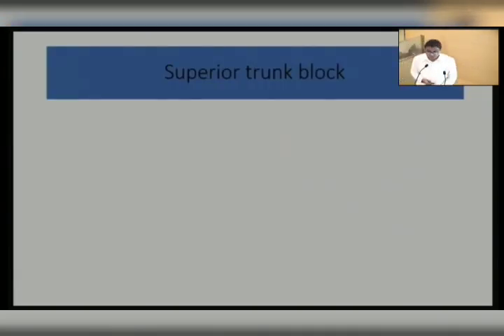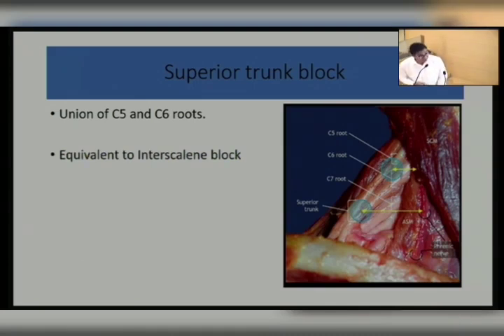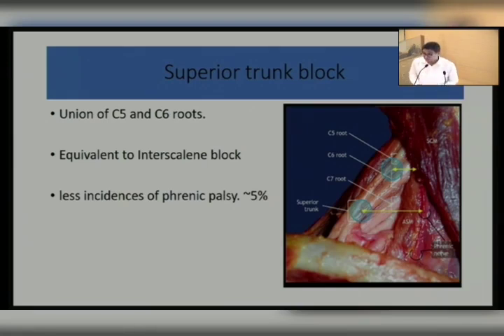So for that reason, our experts have found the superior trunk block, at the union of the C5 and C6 roots. At that point we inject the drug, and the dose that we require is a little bit less. They have started with 15 ml and reduced up to 5 ml, and here we will find phrenic palsy chances are reasonably low, up to 5%. This is based on some studies. And the local anesthetic, I have talked already, 5 to 15 ml of local anesthetic.